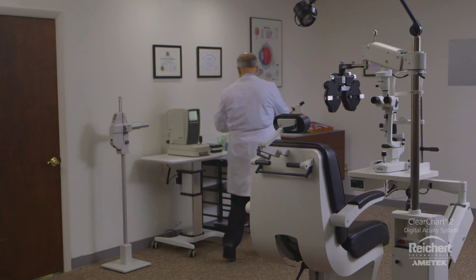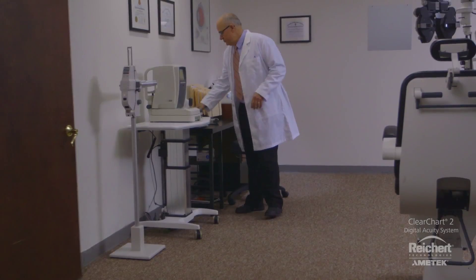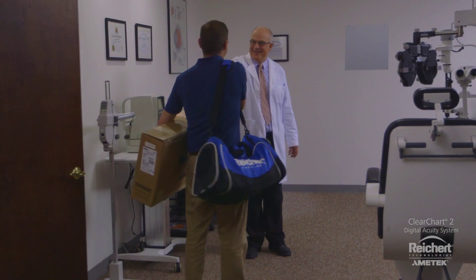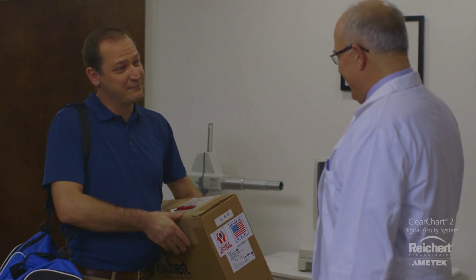Of course, Dr. Wilson did his homework. Although there are countless options, only one digital acuity system is purpose-built and backed by the brand he's come to trust.